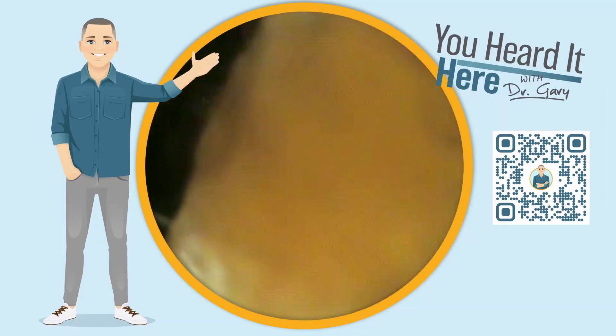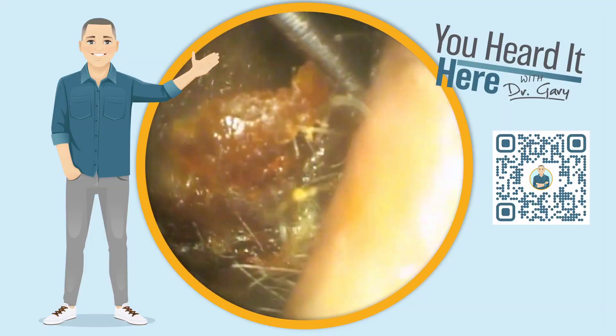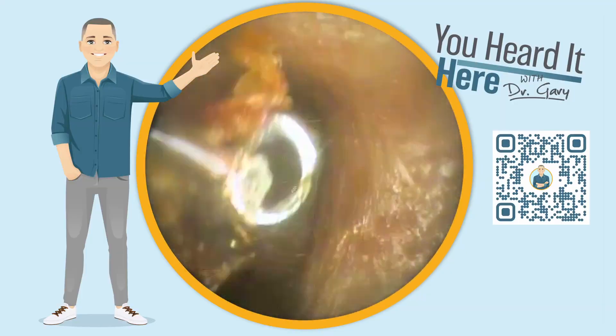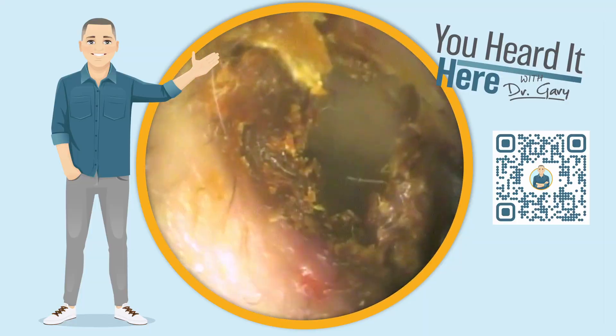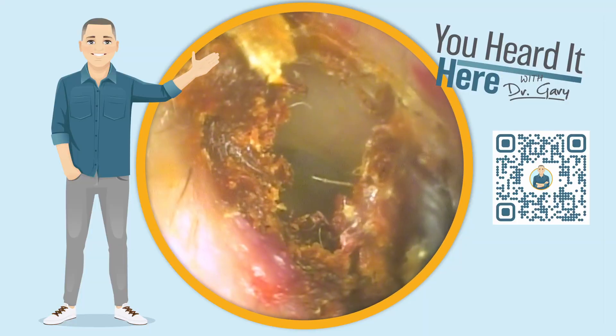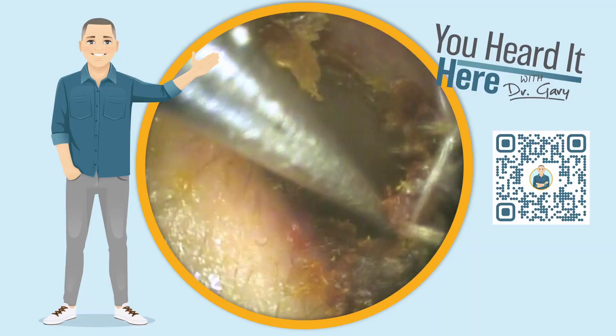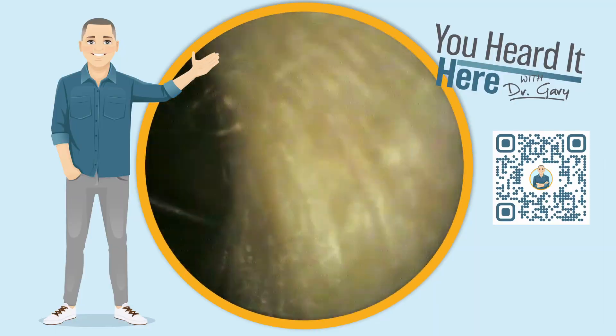You can see a large chunk of wax here in the middle of the ear canal. We've now pulled that off the ear canal wall. As we look back in, you can see the eardrum, but on both the right and the left you can see wax that's just impacted.